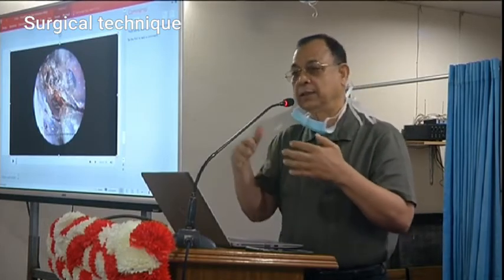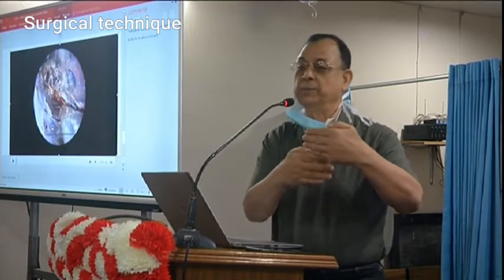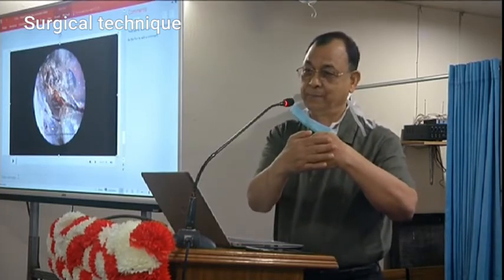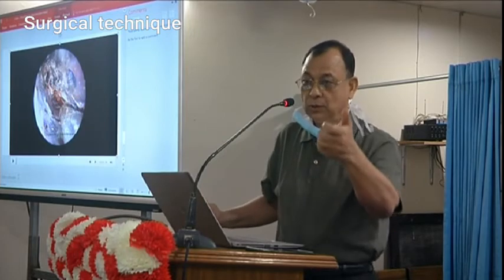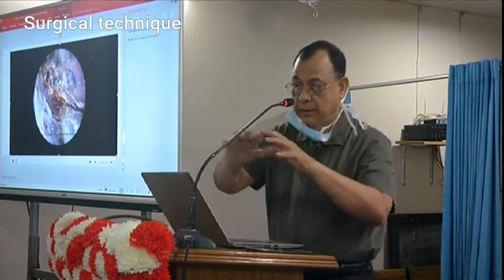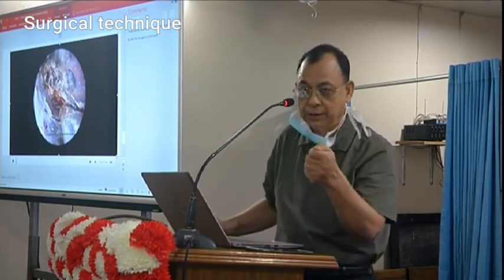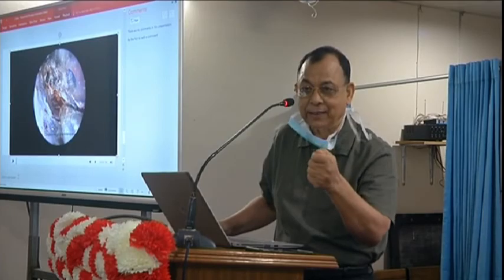By this time, that is the natural pathway again. It makes a clear area of dissection. That is the wall. And once you expand the fissure or the foramina and pull it, then it comes out very easily.